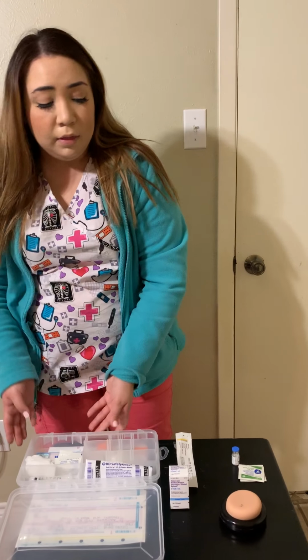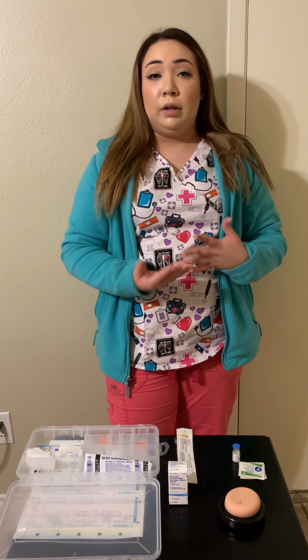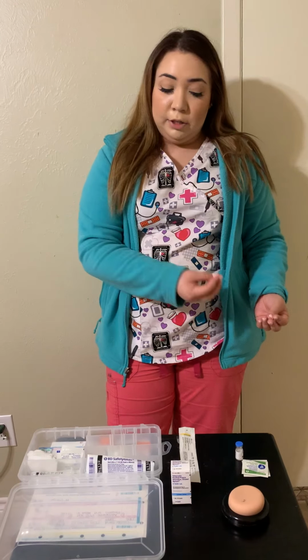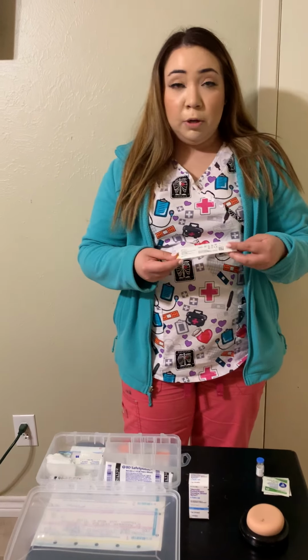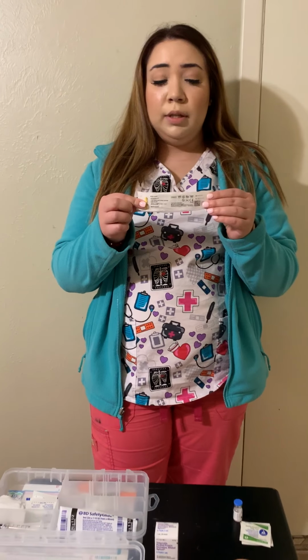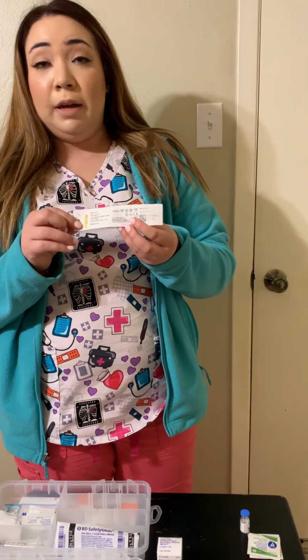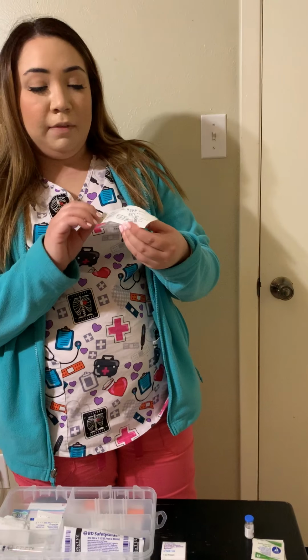Now that we have everything, we want to make sure we verify the name and date of birth with our client. We want to make sure they don't have any allergies, and if not, then we can go ahead and proceed to gathering our materials. Our materials consist of a tuberculin syringe. Our needle measures at 25 gauge with a length of 5/8 of an inch.